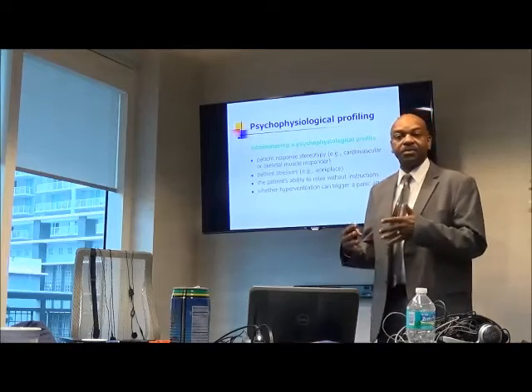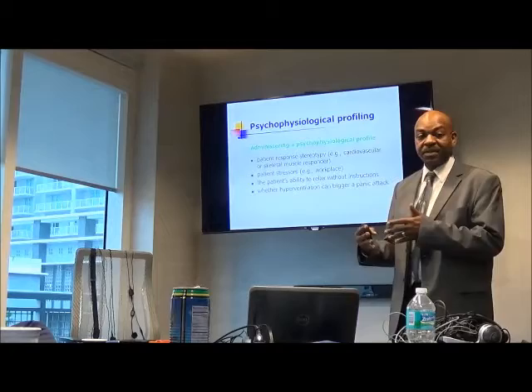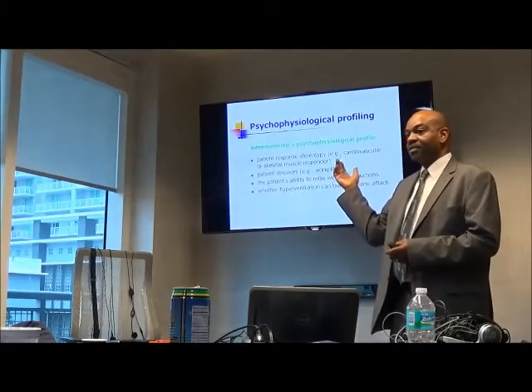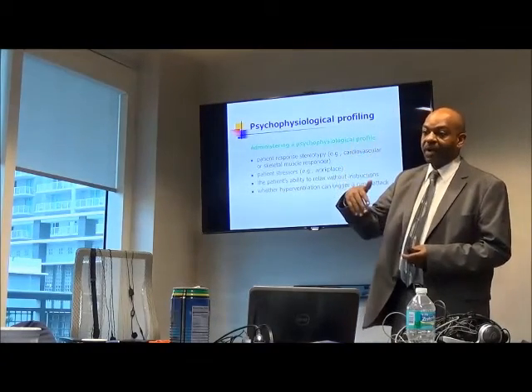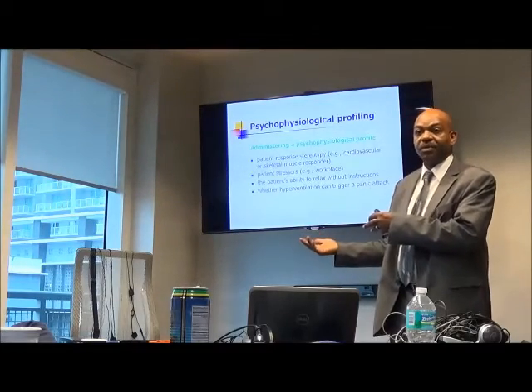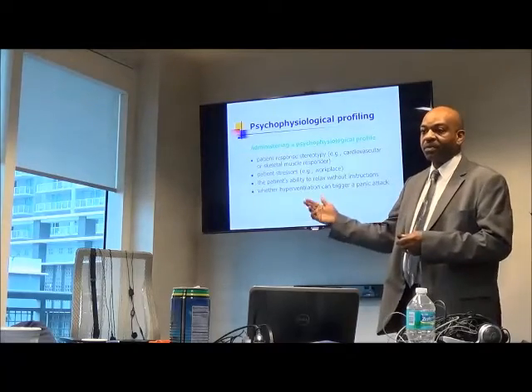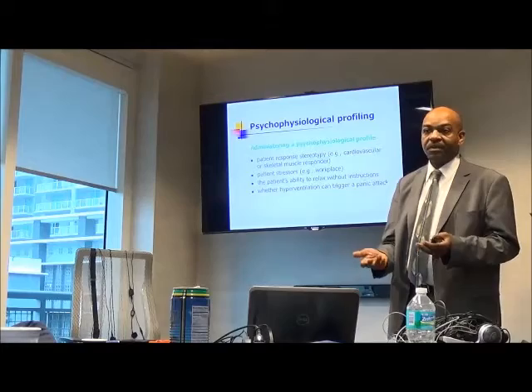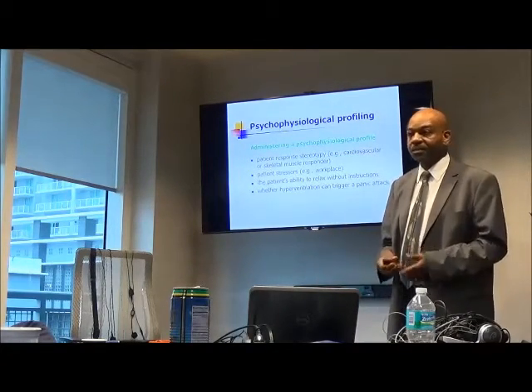And that also helps to make the case for why you're doing biofeedback with them, because if they see, oh, the muscle tension levels were high and they didn't recover well, and I have pain, and they're telling me if I relax my muscles that can help with the symptom, it kind of makes sense. And then especially when you work with them, if they see the levels coming down and if they are experiencing changes in their symptoms, it makes the whole thing make sense.